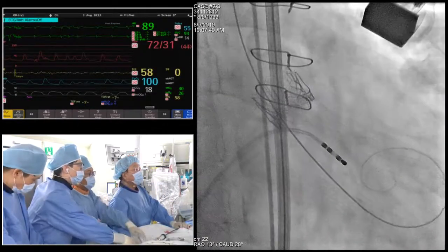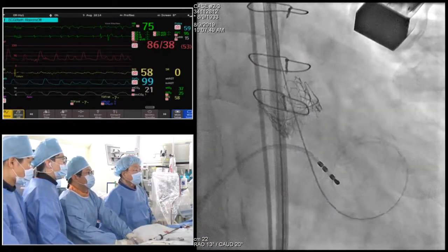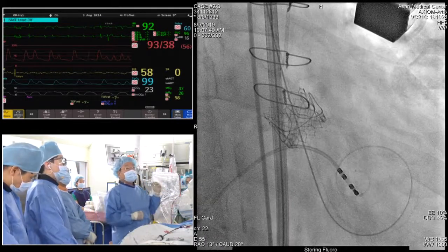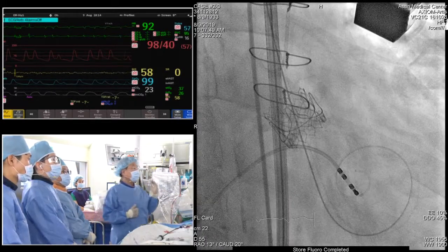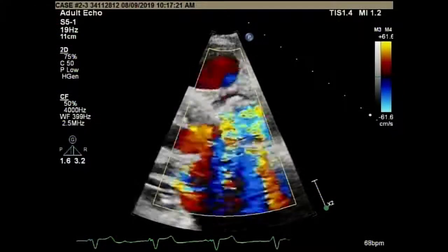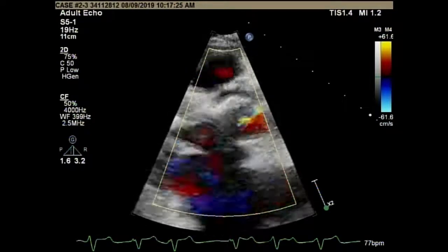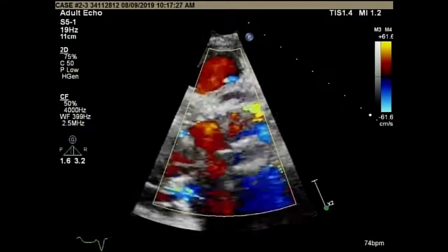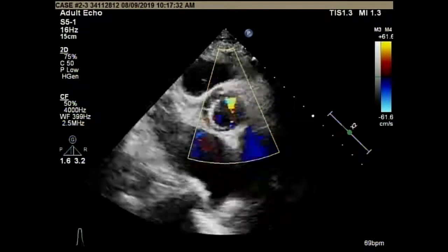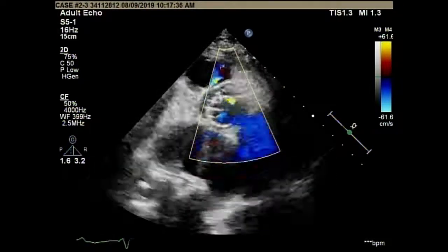Pigtail. We don't have intracardiac echo here, just a transthoracic echo. Oh, really? Professor Kim is here. What do you think about the echocardiogram? I mean, you can see the LV. His aortic diastolic pressure, which was about 30, is now about 50. That looks good. Changes, mainly central AR. Central AR, yeah. Wire dilated, right? Yeah.